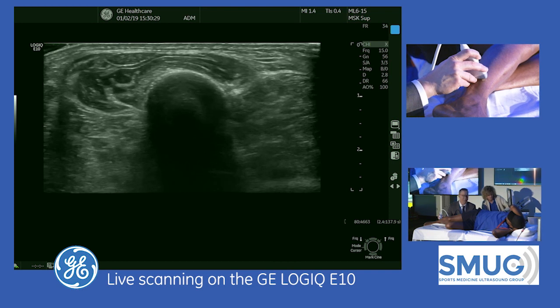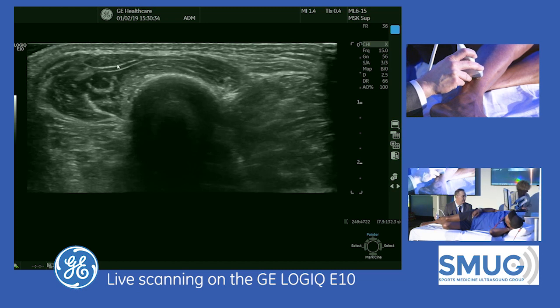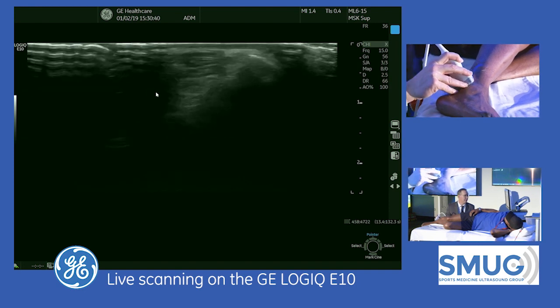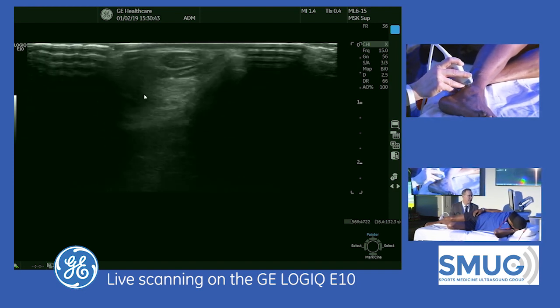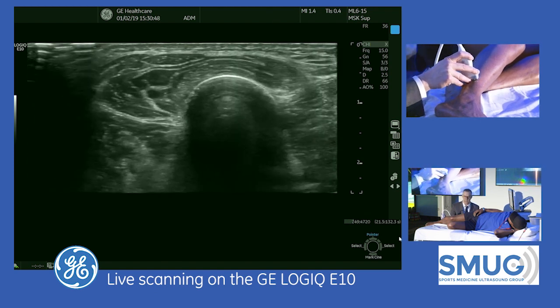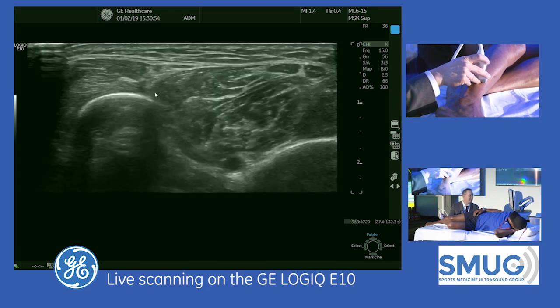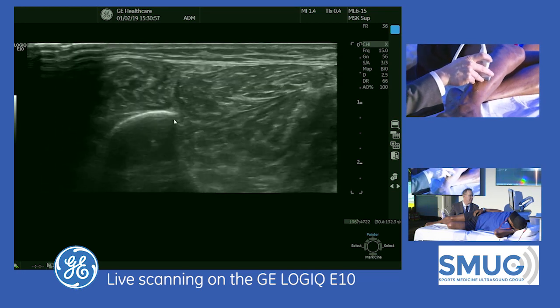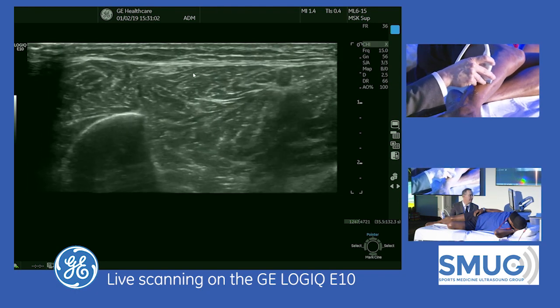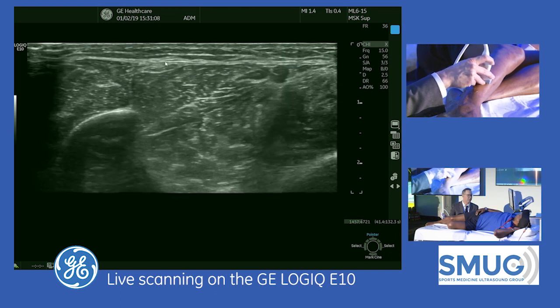I'm going to look for the two compartments to start out with. If I'm not sure which compartment I'm looking at, I can start down at the ankle. Posterior to the fibula is the peroneal compartment as I come up. Here's the peroneal compartment, which means in front of that is the anterior compartment. Looking in this fascial plane, you can see right away the fascicular appearance, the honeycomb appearance — that's the superficial branch.